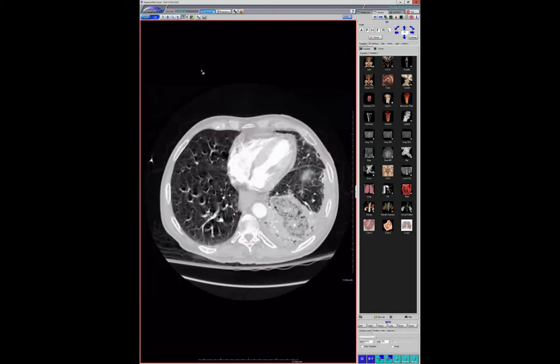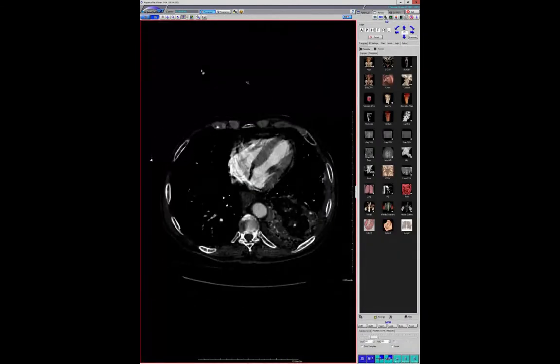So yeah, we thought this was a good looking bird's nest, but this turned out to be staph. Hey Seth, can you change the window and show the vessels there? I was just curious if there's like any.